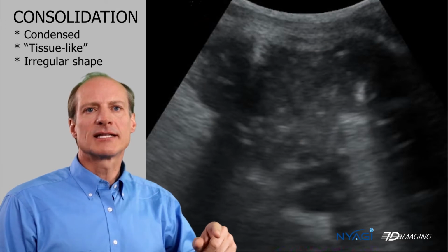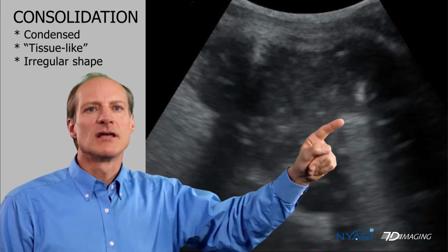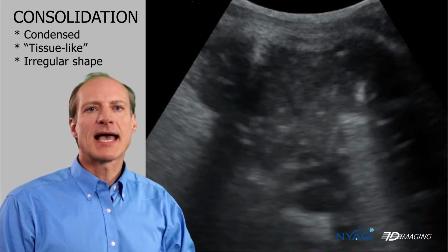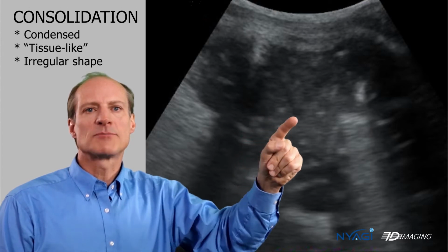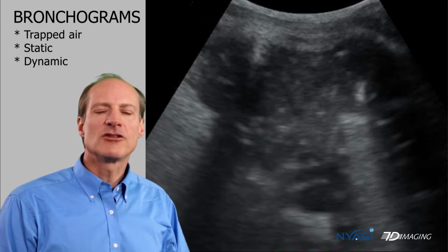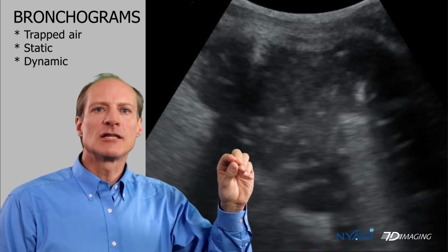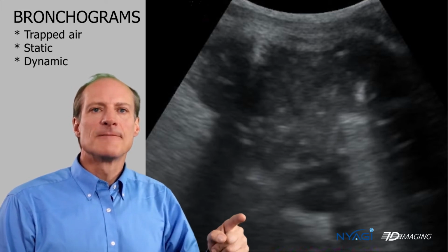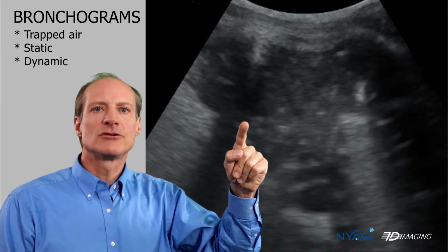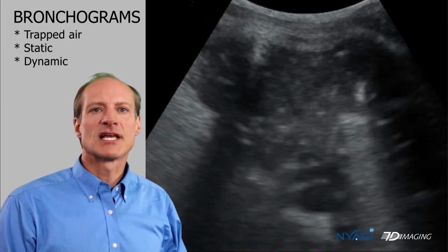As the lung gets wetter, it may consolidate. Here you can see consolidation of the lung. There's a dark, irregular mass filled with small, bright white spots. The white spots are called air bronchograms. They can either be static or dynamic. Dynamic is oftentimes seen in lobar pneumonias, but in this case, this represents static air bronchograms, which are trapped little air lobules that reflect back to the ultrasound probe.